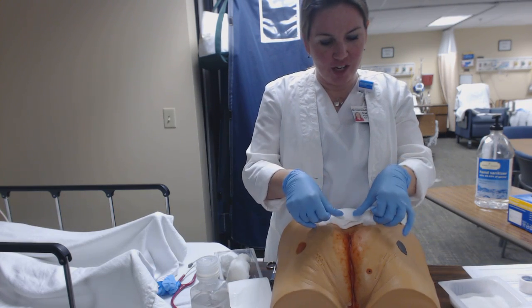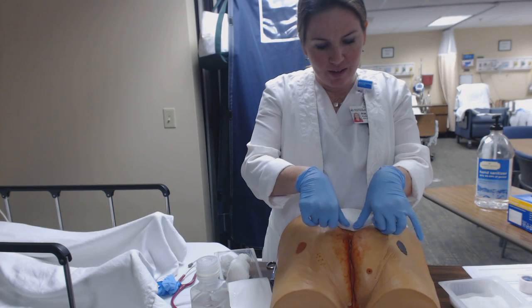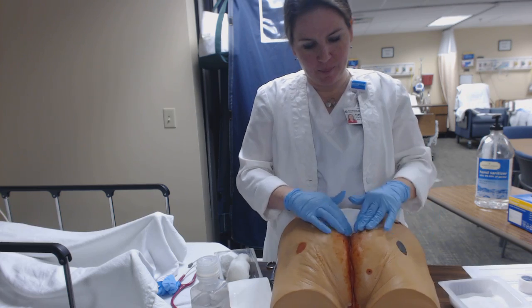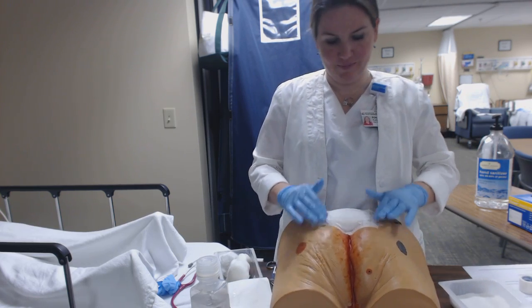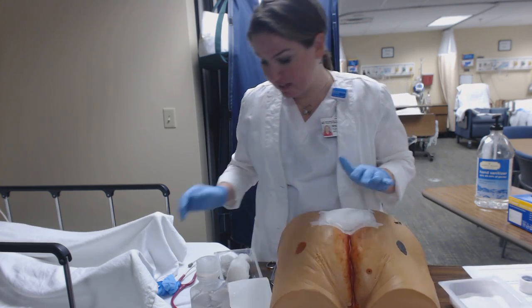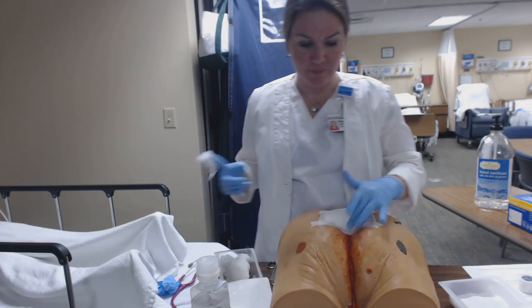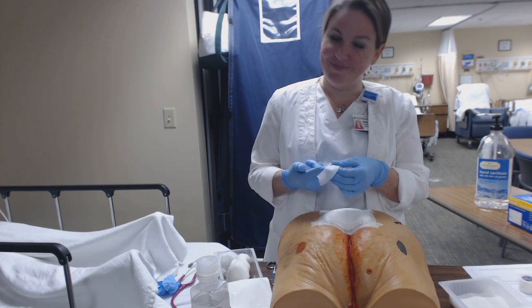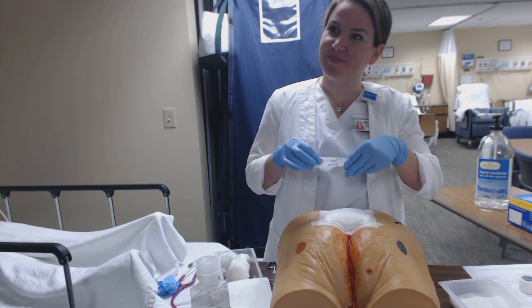So instead of just going straight across, I'm going to have my tape move with the body. I think that will help so stool doesn't get up inside that wound, right, Miss Canby? Yes, that's very good, Miss Palmer. It's very close to the anal opening, so I could see how stool would go into the wound.